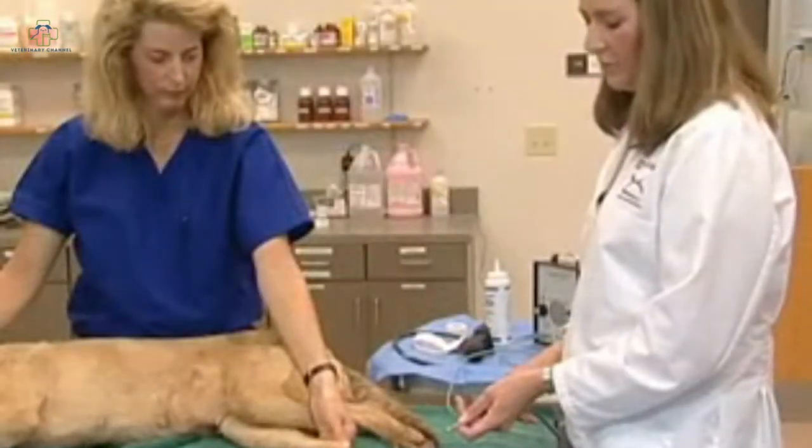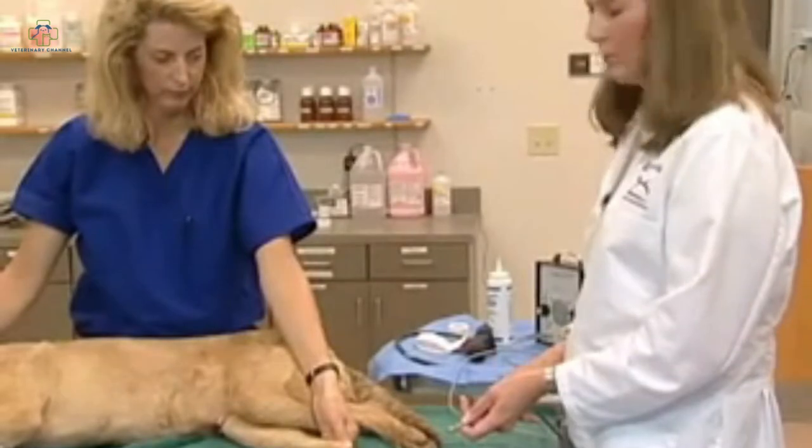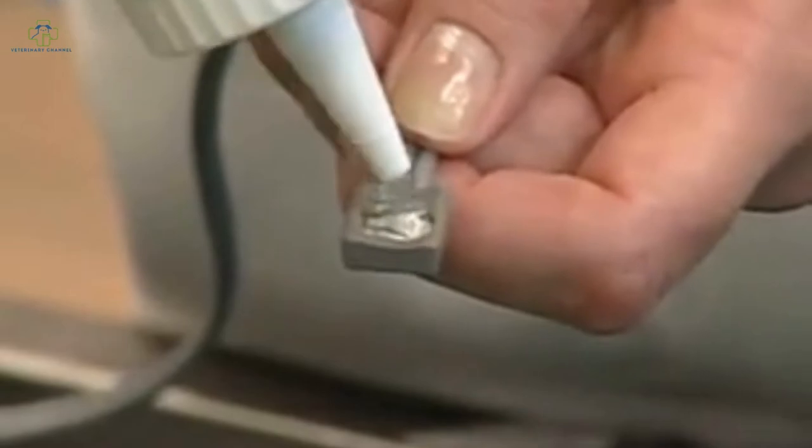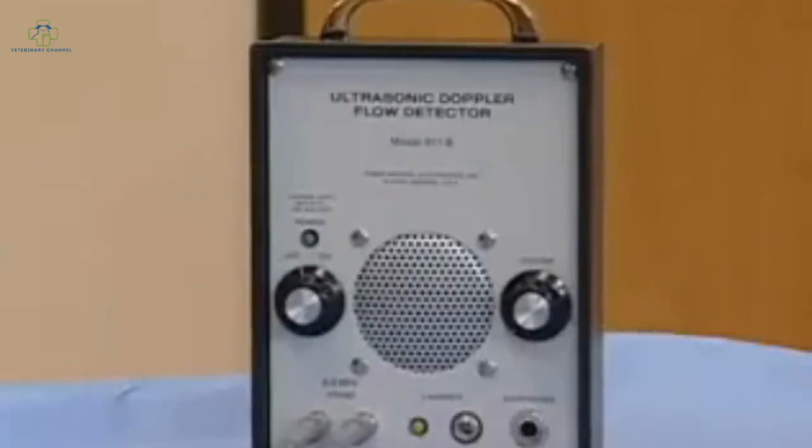Once we've located a good pulse, we can go ahead and apply the probe. For this, we need to apply coupling gel to the concave surface of the probe.